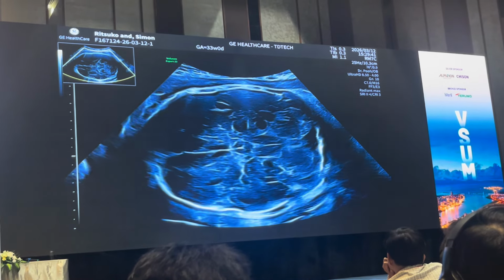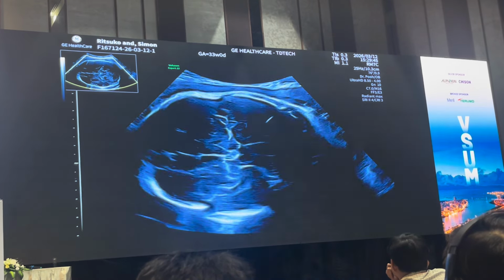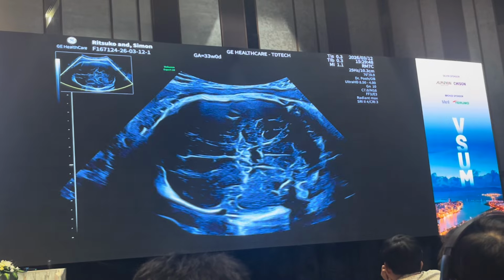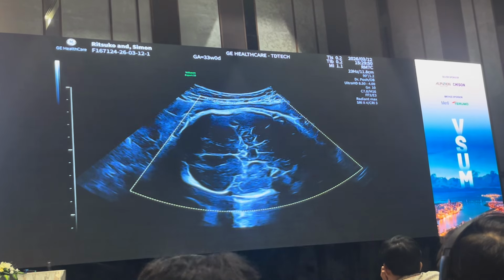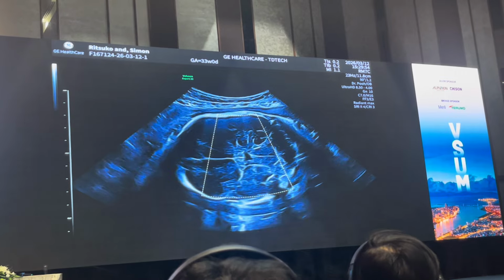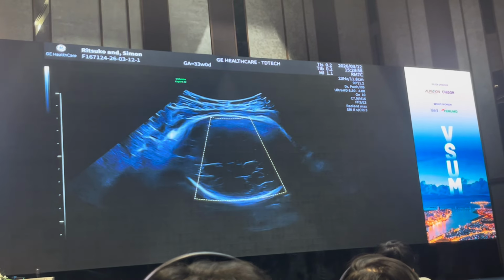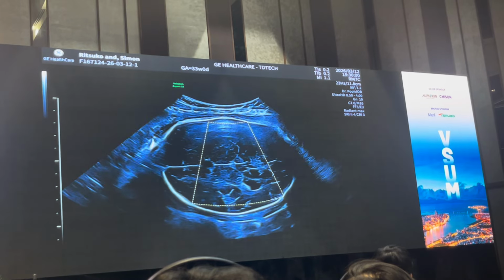I'd like to see the optic chiasma. Let's go straight into the deep end, the optic chiasma. So for the optic chiasma, I go down to the base of the brain. So this is up at the superior, down to the level of the midbrain brainstem.